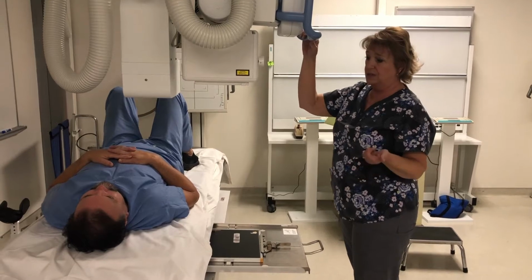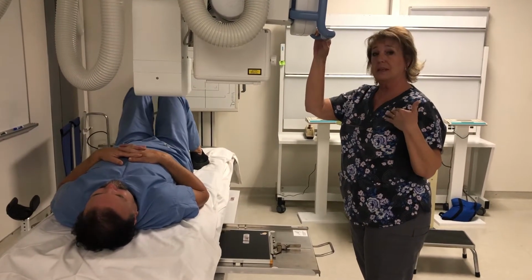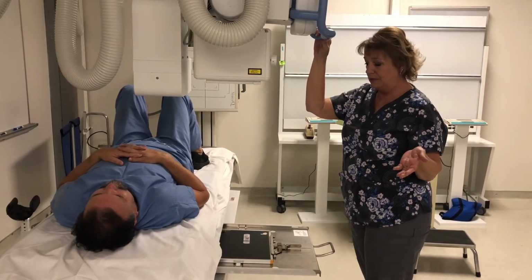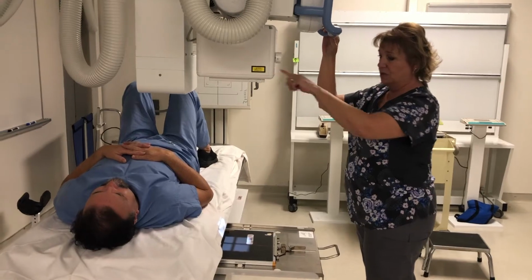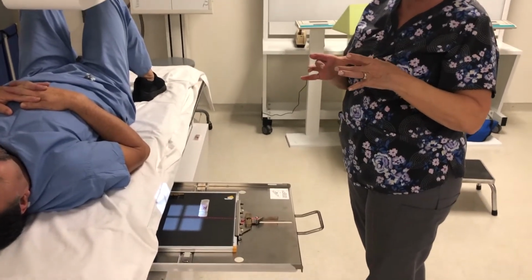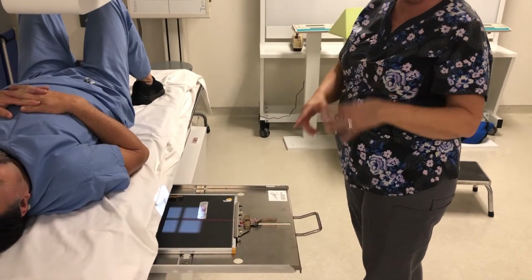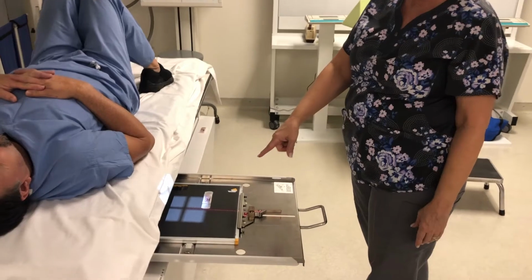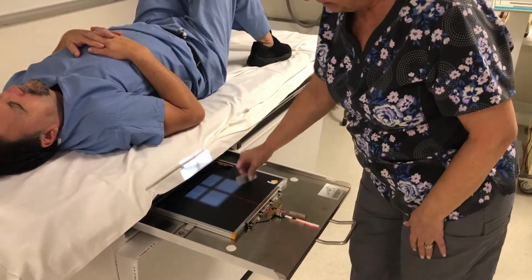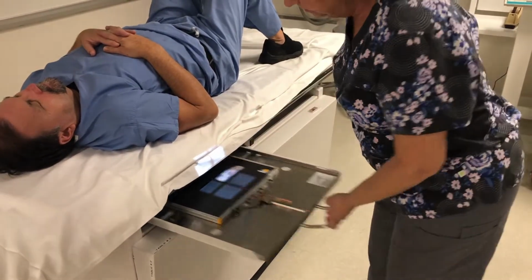So I'll start out with the open mouth, although if I was doing this series, I would probably do the AP first, but I'm going to show you the open mouth first. The collimation for this is quite tight because really we're just collimating to around what will eventually be his open mouth, so it's pretty small collimation. I would say 4 by 4, and I've placed my right marker just inside the field of view.